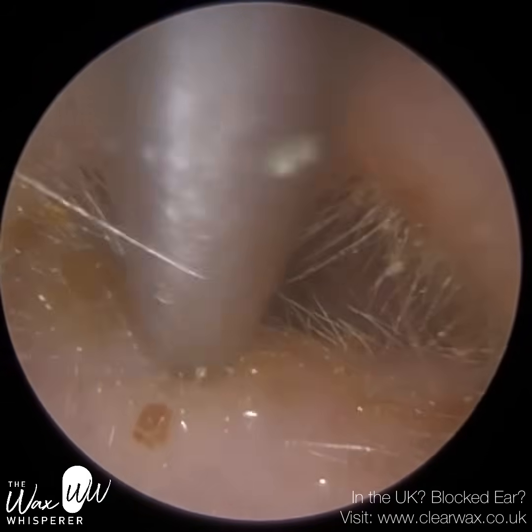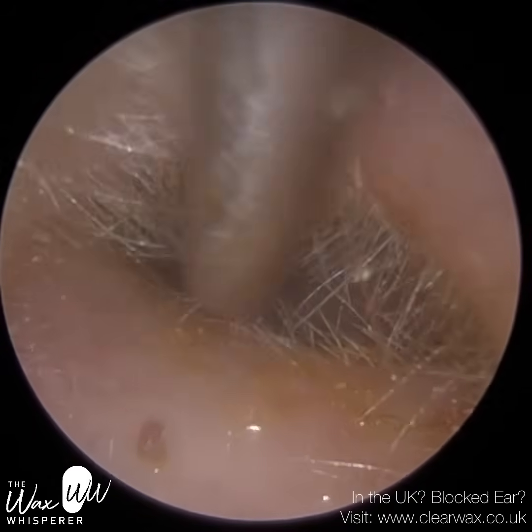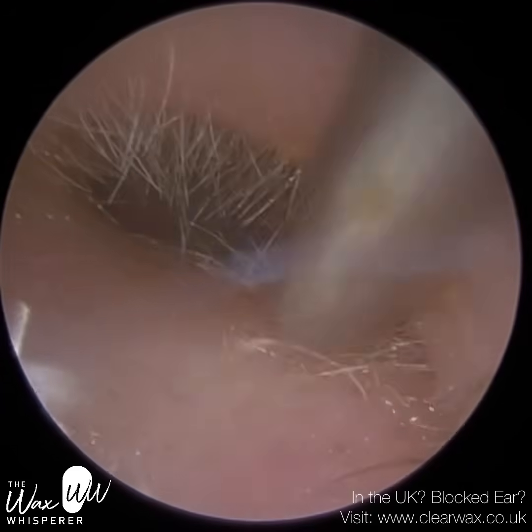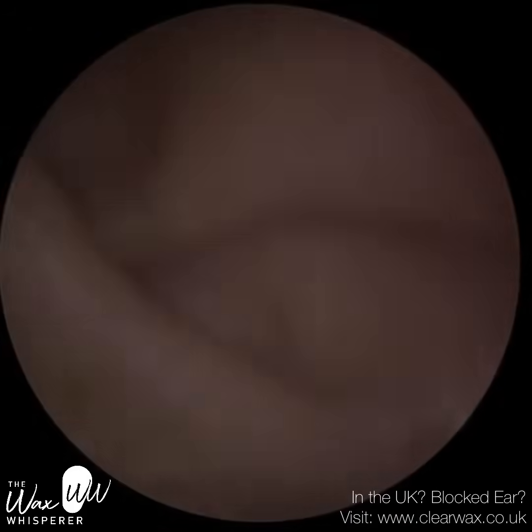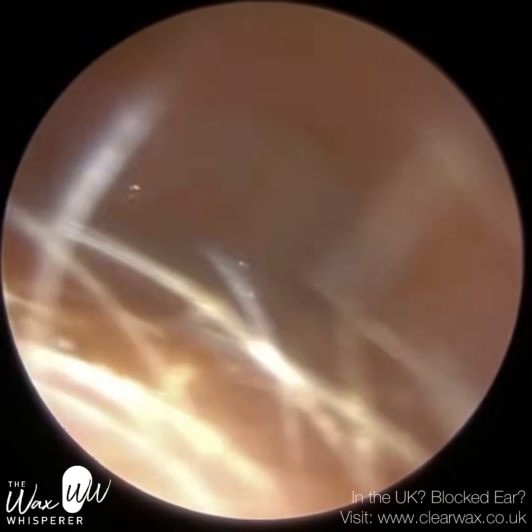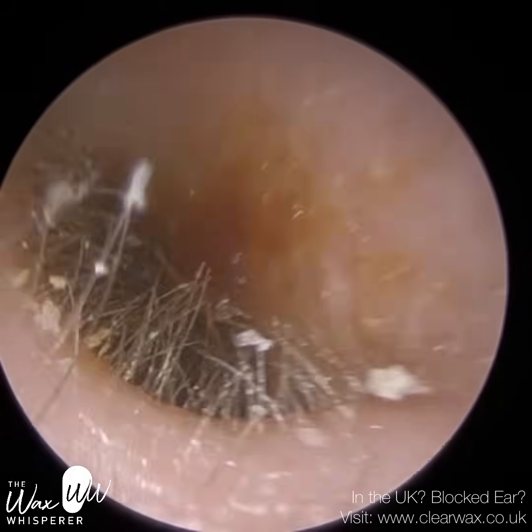That gives you some perspective for how narrow the patient's ear canal entrance is. As you enter the ear, the further into the ear you travel towards the eardrum, the ear canal does get a bit wider, but the entrance is quite narrow. I'm just navigating those hairs, and that's the eardrum. So that's the patient's left ear complete.